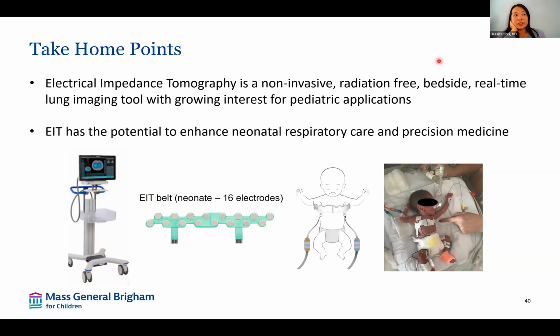Yeah, and other things we could use other than EIT to help with optimal PEEP, you could look at the loops on the ventilator, but it could be challenging if the patient does not have a cuffed tube and has a considerable amount of air leak. But the ventilator could comment on where PEEP compliance is, so you could judge based on that.